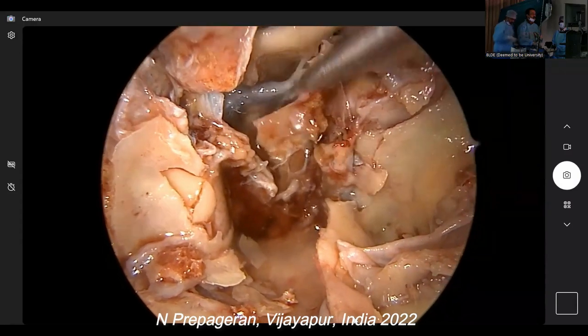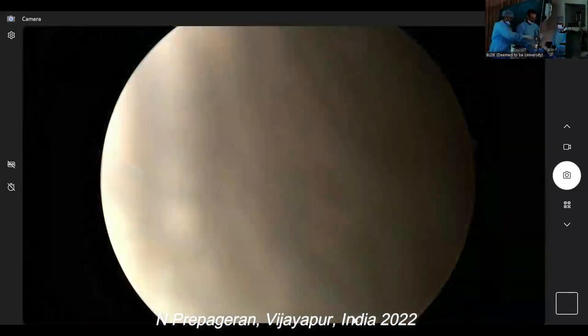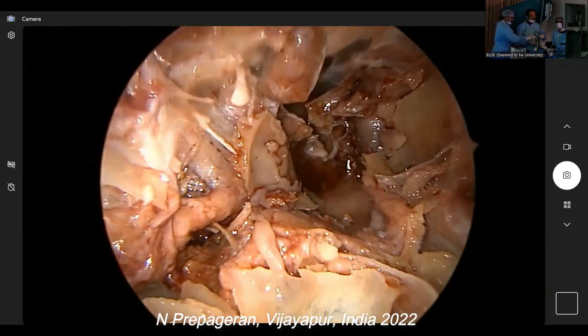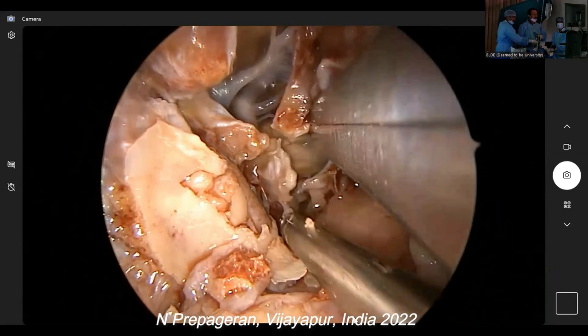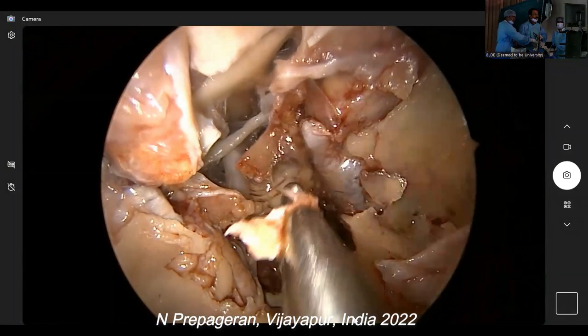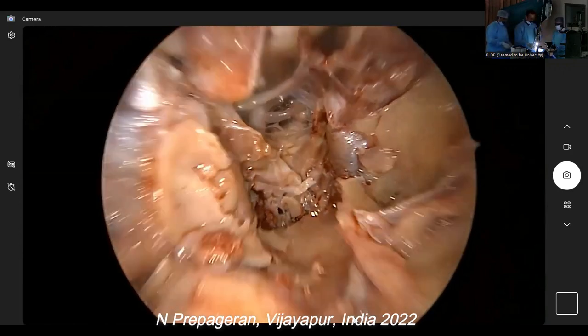Can you punch? Get a 30-degree scope ready, yeah? So when you do a transclival, what do you see? Mr. B. In India, Mr. B is Amitabh Bachchan, right? Yeah. For us, Mr. B is basilar artery. There. Can you see, guys? Clean again.